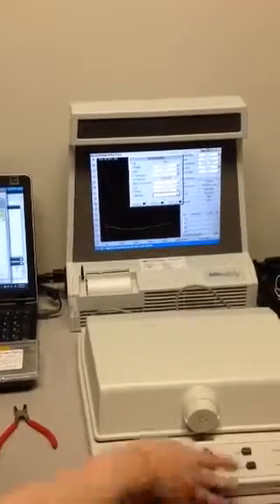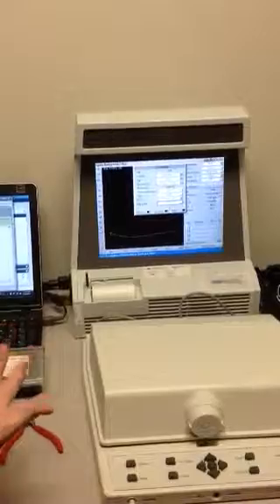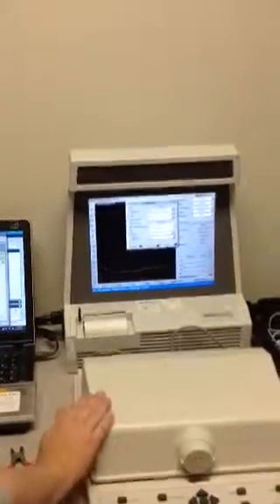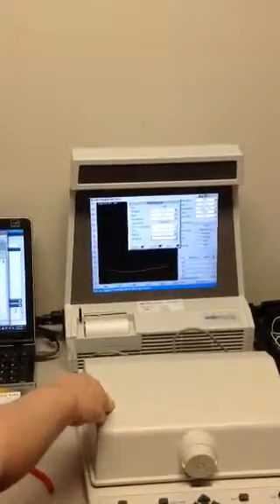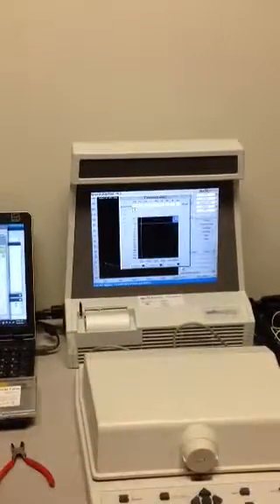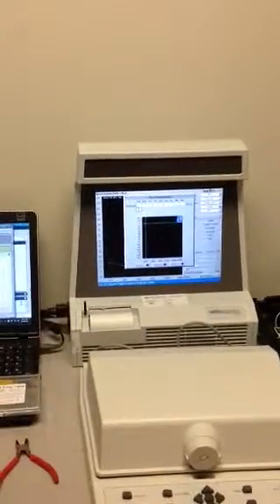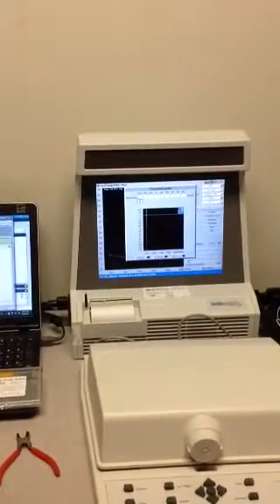If we said it was binaural, it would reduce the settings by 3 to 5 dB to account for binaural summation. So the patient will perceive the settings to be louder if it's being calculated for both ears. So right now we're going to reduce that. So that means because I selected only one ear, your settings will be 3 to 5 dB higher because you're only wearing one ear.